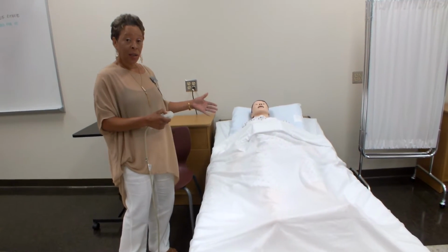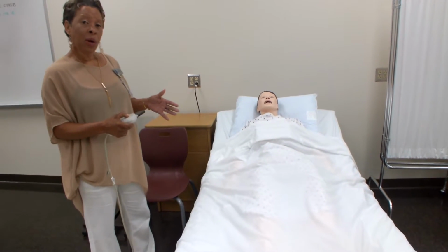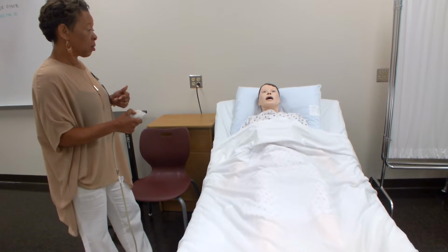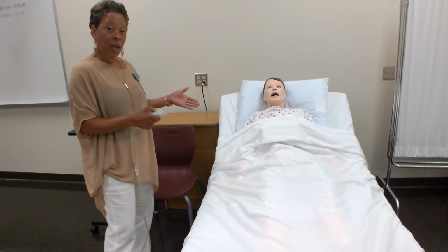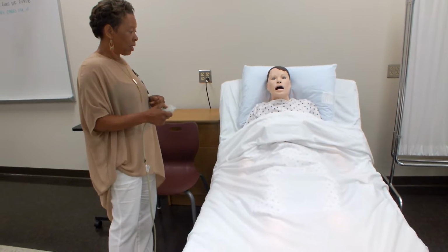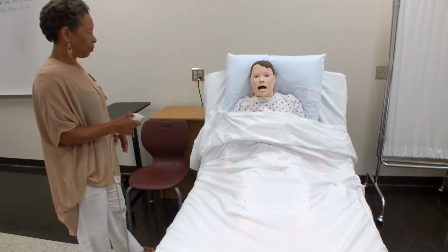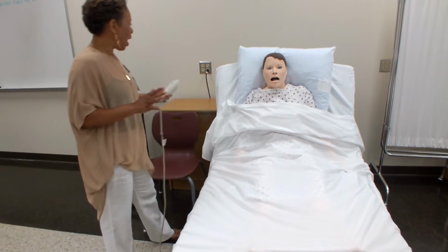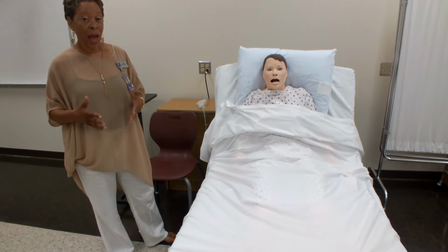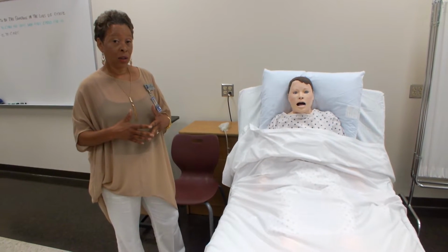The client or the candidate that is acting as the resident can always readjust themselves, okay, once that head of bed is raised to 90 degrees. So that's what I'm doing right now with Nurse Annie. I'm raising her head of bed all the way to 90 degrees. There we go. That way, the NAE is not going to have any questions as to whether or not that bed is in a high Fowler's position.